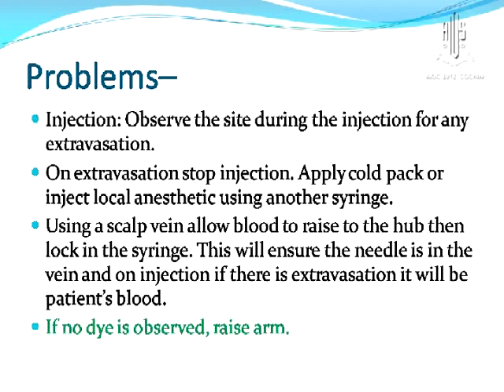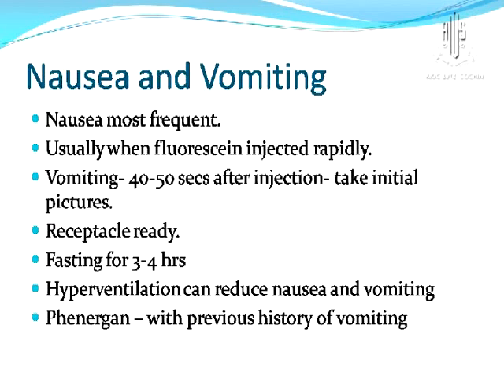If you use a scalp vein, just allow the blood to rise to the hub and then inject. So the initial injection will be the blood of the patient. So generally, extravasation, if it happens, does not produce too much pain. In some cases you might observe no dye. Just because you have flexed the hand, sometimes you won't get any dye, so you just need to raise the hand. The other common problem is nausea and vomiting.